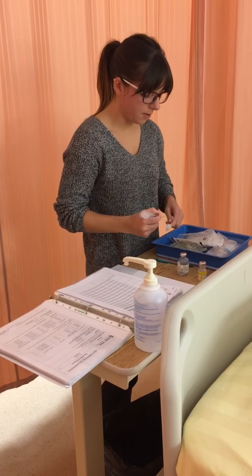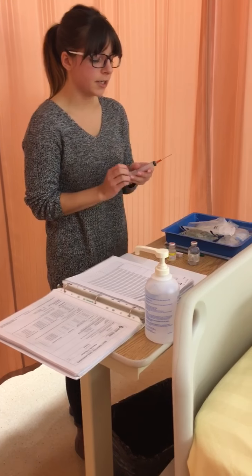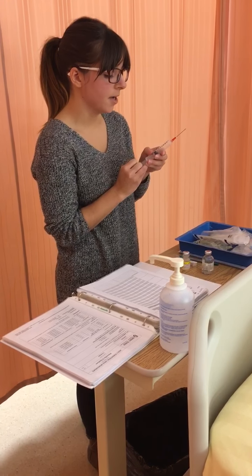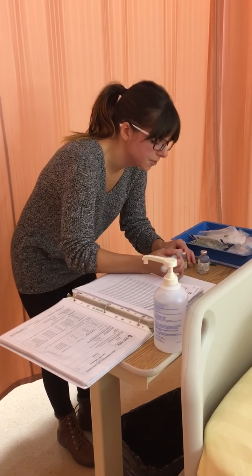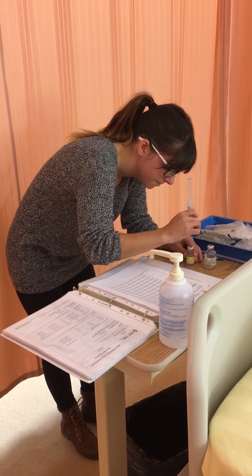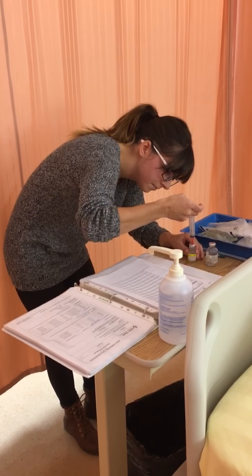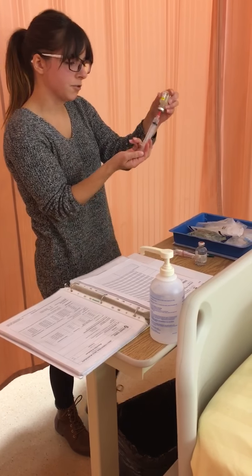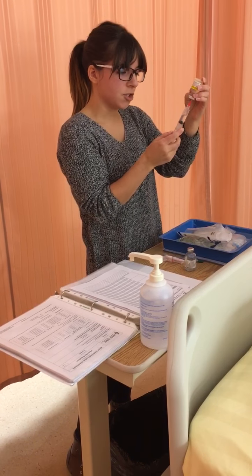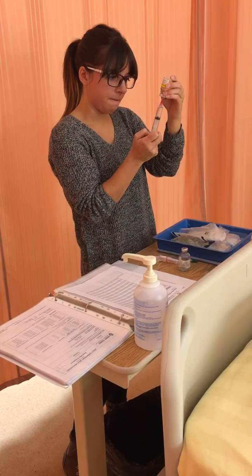I'm going to then withdraw 8.2 milliliters of normal saline. I'm going to first draw back 8.2 milliliters of air and insert that air into the vial. Now I'm going to invert it and withdraw the normal saline, making sure that there are no air bubbles in the syringe.